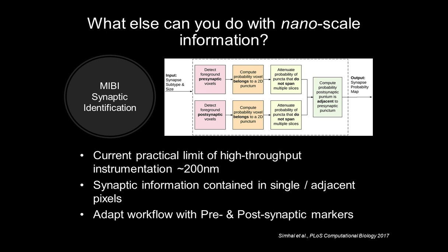And the good news is that, just like with a lot of the antibodies and reagents we're leveraging to do these assays, people have thought about this problem already, and they've thought about it using fluorescence technology. So this is just one example of a paper.